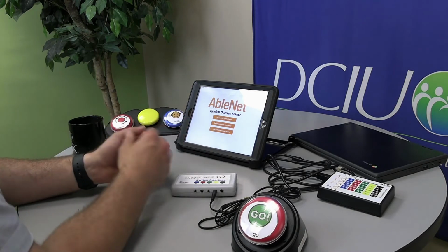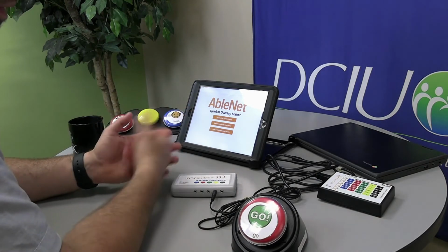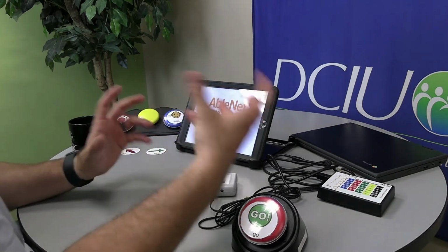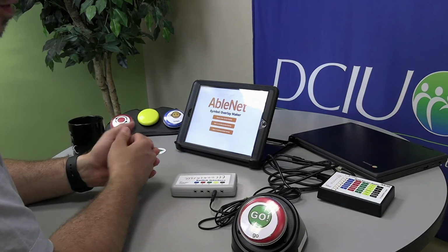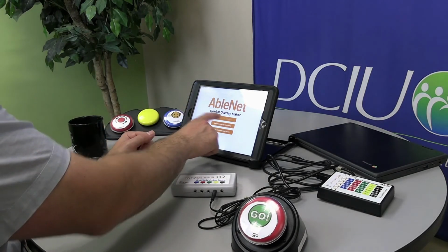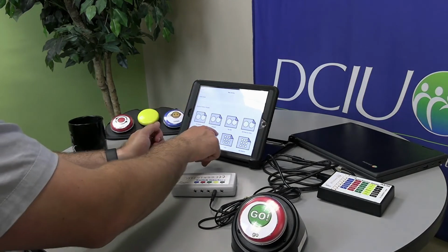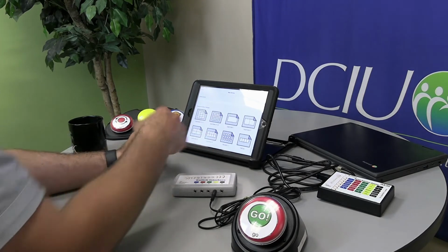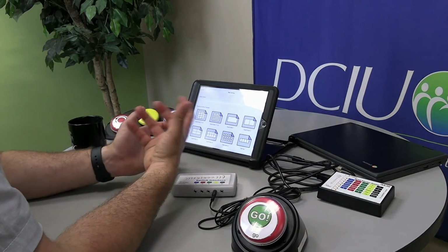So the way it works is you have three choices. You can do a new symbol overlay, open one you've been working on, or copy an existing overlay as well if you'd like to keep consistent with the device but change some of the vocabulary words that you want to incorporate into the student's day. So if we go ahead and click Create New Symbol Overlay, you'll notice here that you can give it a name, and then there are plenty of different device overlays that you're able to populate with symbols specific to the student to go ahead and print.